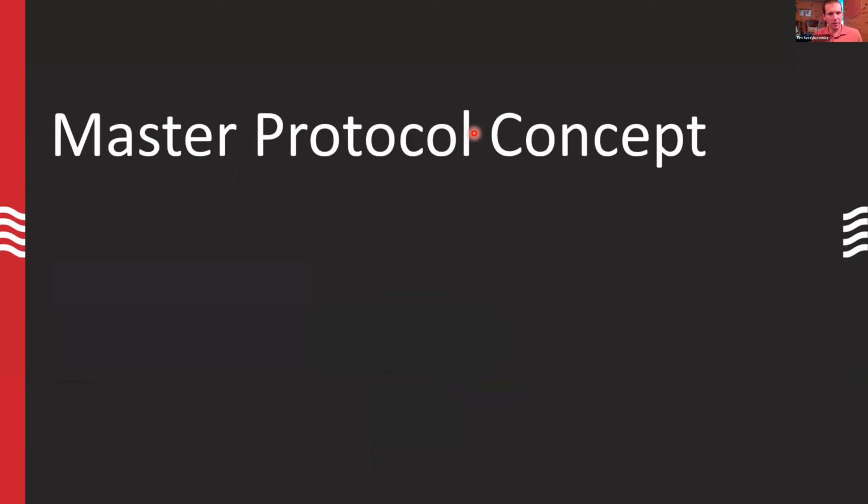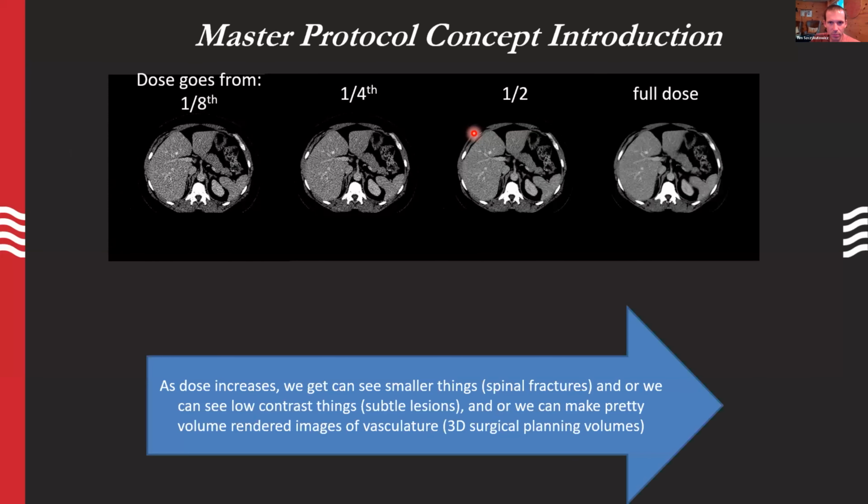All right, so the last bit of the talk today, and then I think we'll have some time for questions before 4:45, is I'll talk about how to keep track of, manage, and optimize these protocols. This is one thing that some of the audience might have heard us talk about at Wisconsin before, but I have some new stuff in here, and we'll review this master protocol concept. What this master protocol concept is, is a way to both optimize and organize your protocols across patient size.